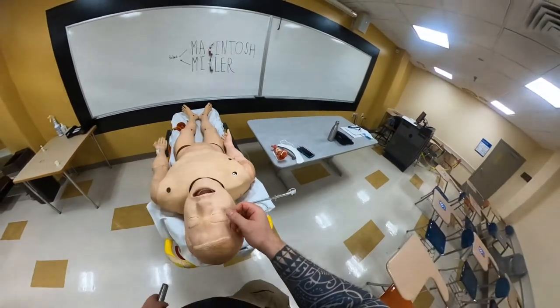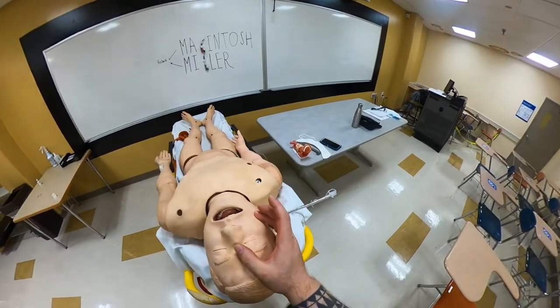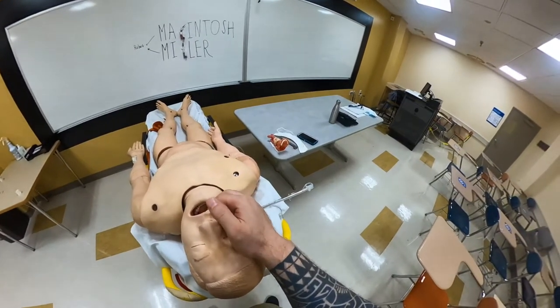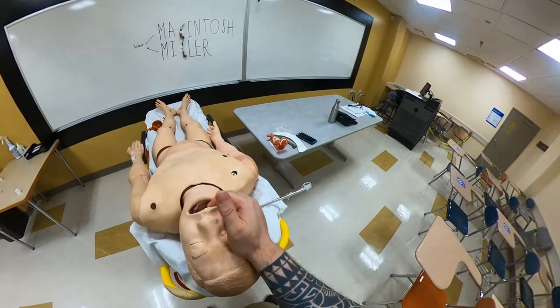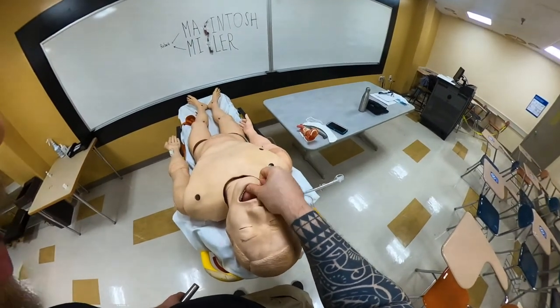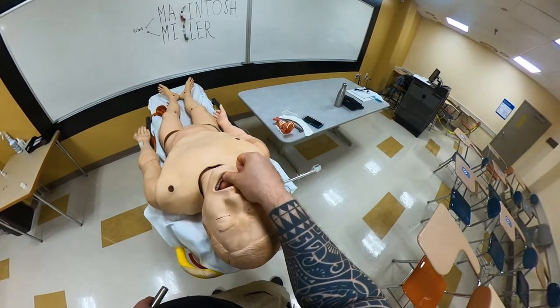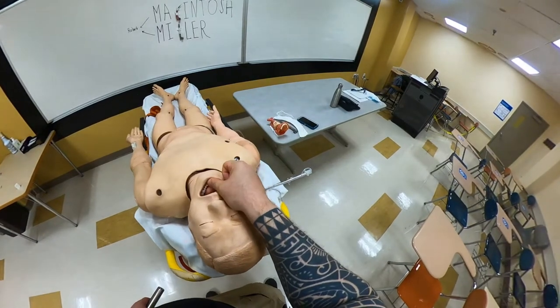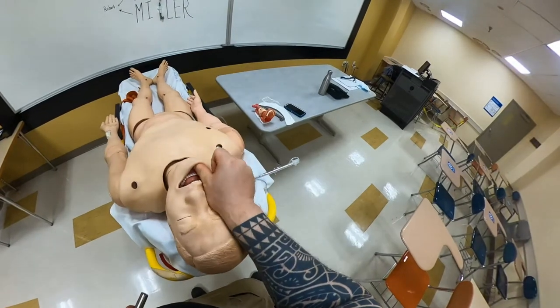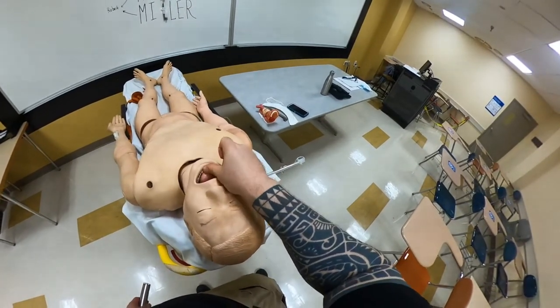When you're in position, the first thing you want to do is open the mouth. The way you're going to open the mouth is the cross-finger technique or scissors technique: take your middle finger and put it at the top incisors, then take your thumb and open the mouth. If the patient has higher or intact mental status and your induction drugs are not on board, the patient can bite you. An alternate technique is to find the lip and open the mouth using that technique. Both techniques facilitate opening of the mouth.